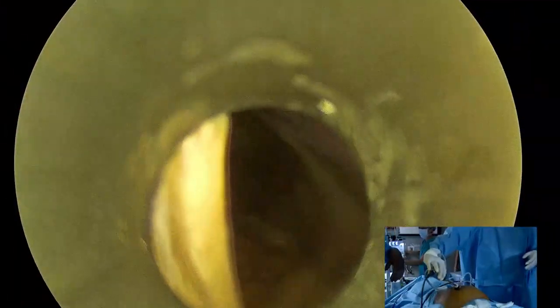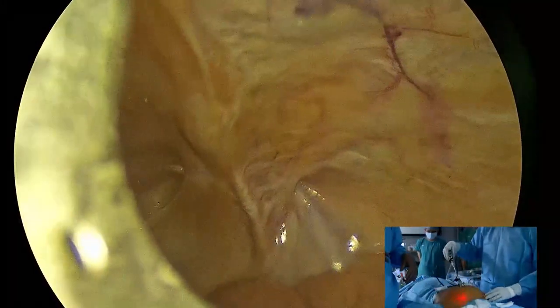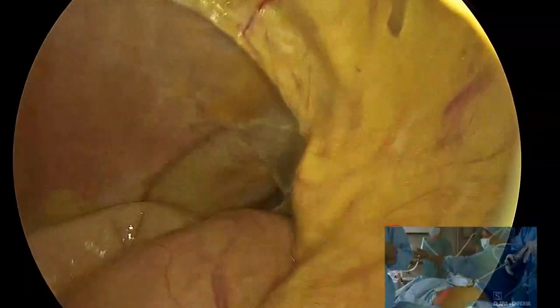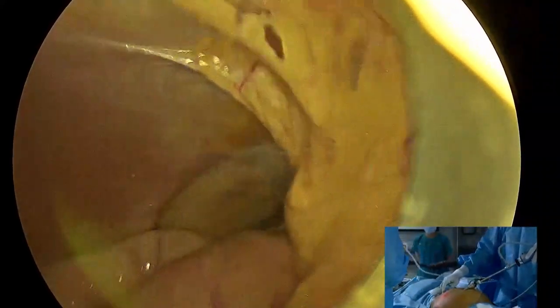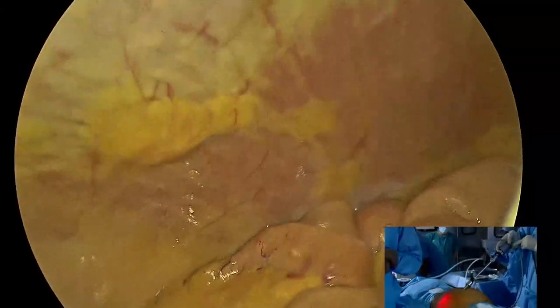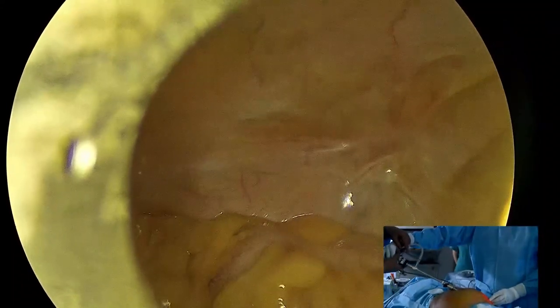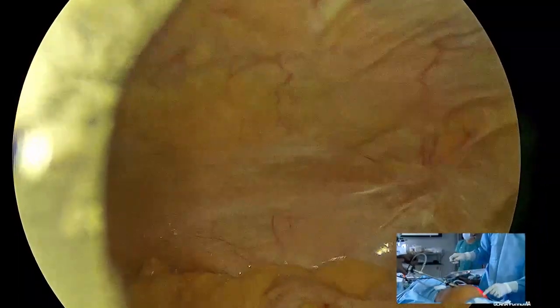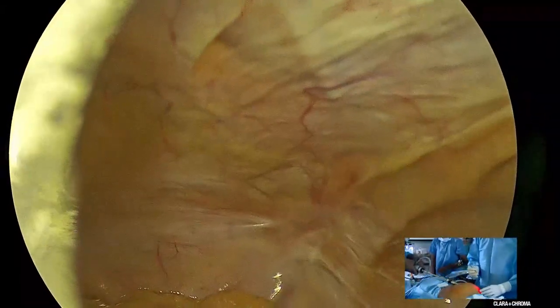So, these are adhesions from the previous stomach surgery, so we try to get them. No recurrence of hernia? No. These are on the right side. So, the place where I normally put my right operating port is not accessible because of these adhesions, so I'm going to do it in a slightly unconventional way. There is a scar here already from a left inguinal hernia repair, open repair. Yes, I'm just going in the same scar.